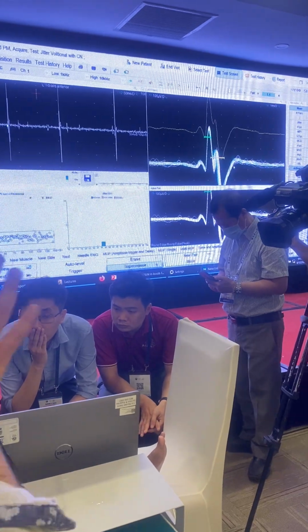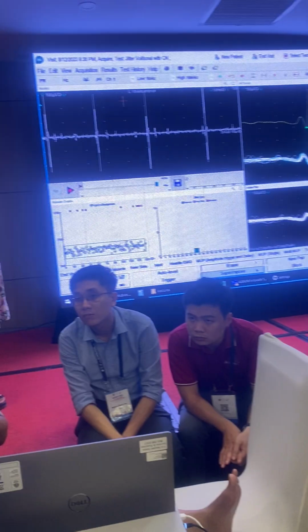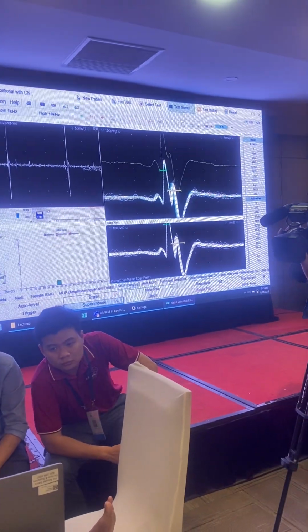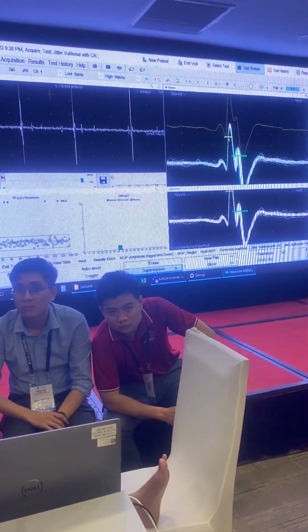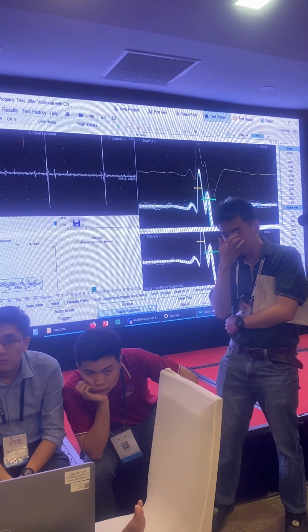Sorry, if I may just ask, yeah. So you can either use peak or onset in this case, right? So over here you use the onset, is it? No, I'm using the peak now. Okay. See, on the rising edge, I'm using the rising peak. Okay. Rising peak. So now let me try to go to the next recording over here.